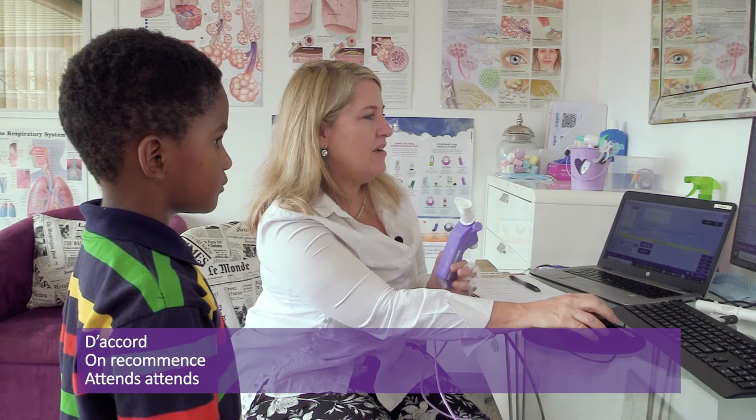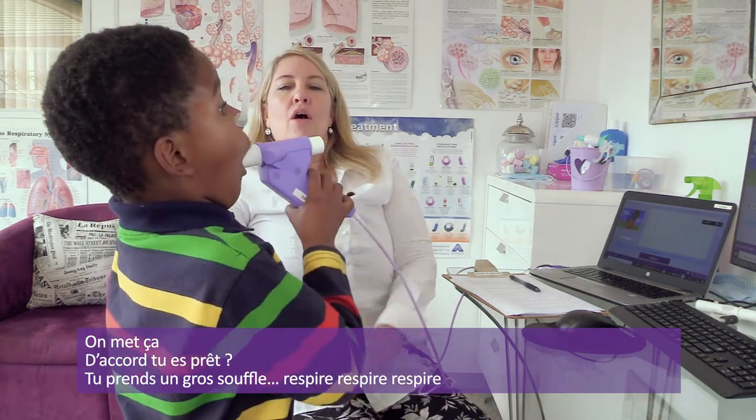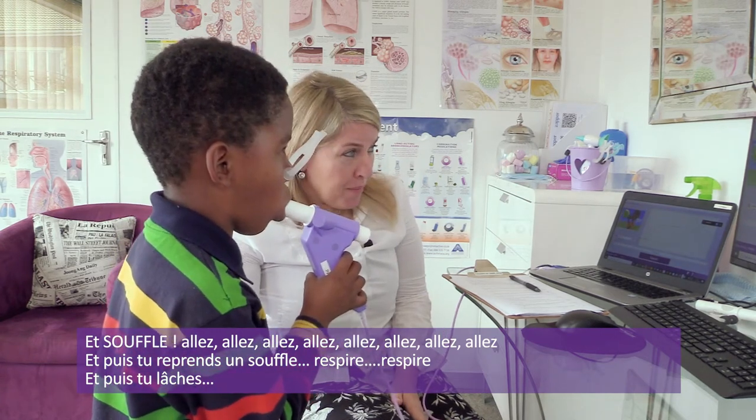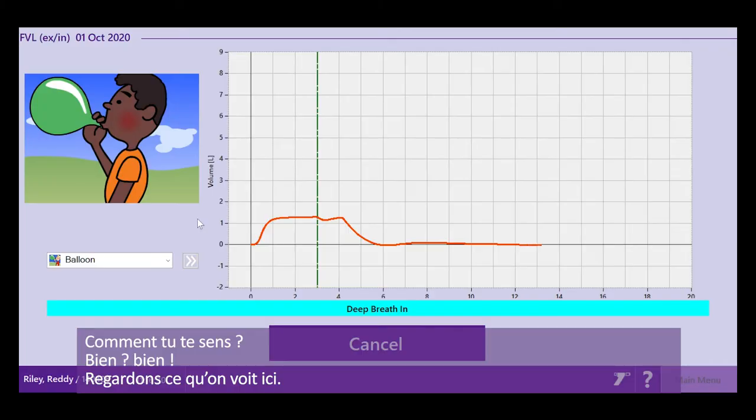All right. Okay, so let's give it another try. Wait, let's put this on. Okay, are you ready? Big one. Go. And breathe in and rest. Okay, take it out your mouth. Just rest for a moment. How are you feeling? Good, good. Okay, right, let's see what this one shows us.